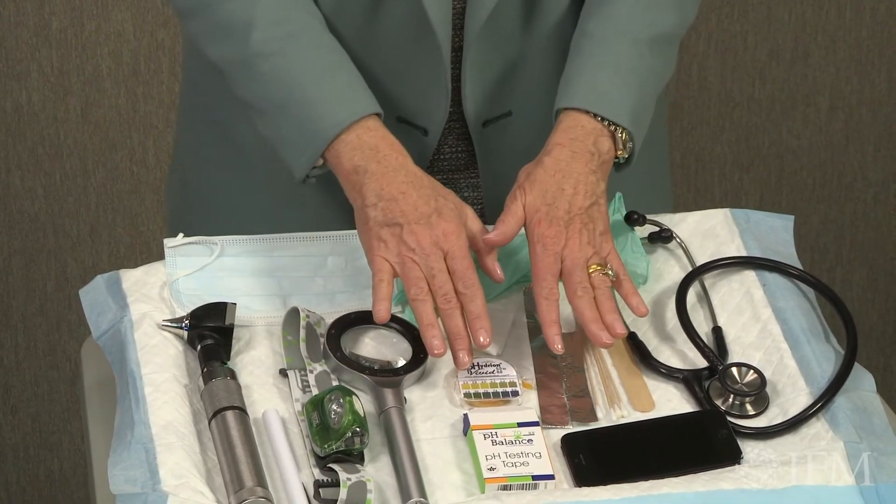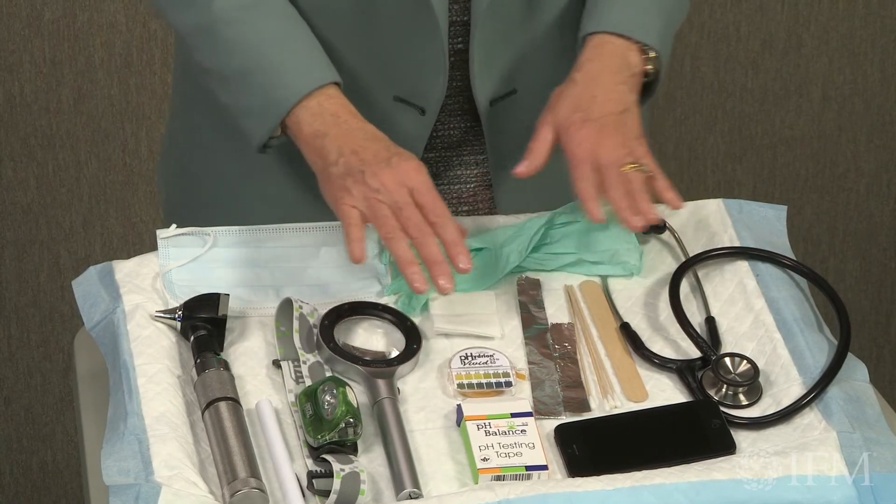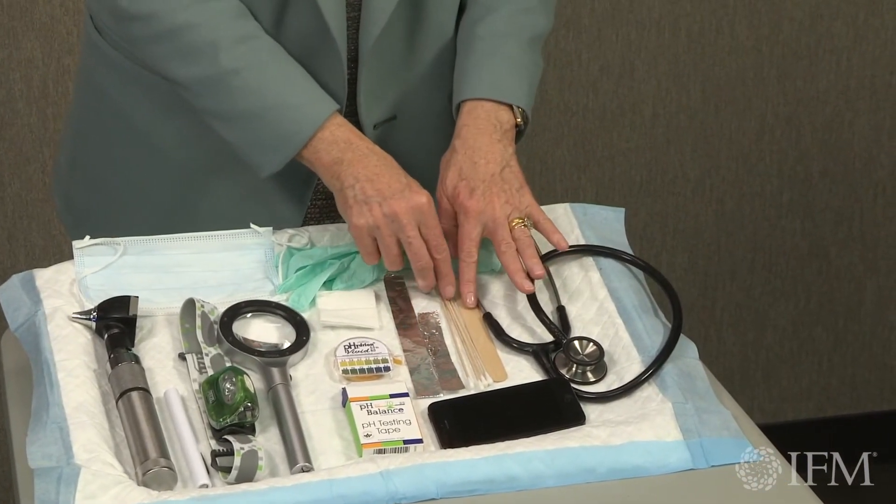You'll want pH paper to assess and evaluate the acid-base relationship of the saliva. You'll want some gauze to hold onto the tongue and move it from side to side. Aluminum foil strips are very helpful for determining the presence of galvanic activity between dissimilar metals or mercury amalgam alone. Q-tips and a tongue depressor are also needed. The Q-tips are helpful to run along the edge of the gum tissue to see if the gums are bleeding, if there are any sores, or any exudate — fluids being expressed from the gums. You can also use a Q-tip on lesions of the cheek to see if they rub off or are firmly attached. The tongue depressor is for moving the tongue from side to side, moving the cheeks out of the way, and putting the tongue down so you can better visualize the throat and oral pharynx.